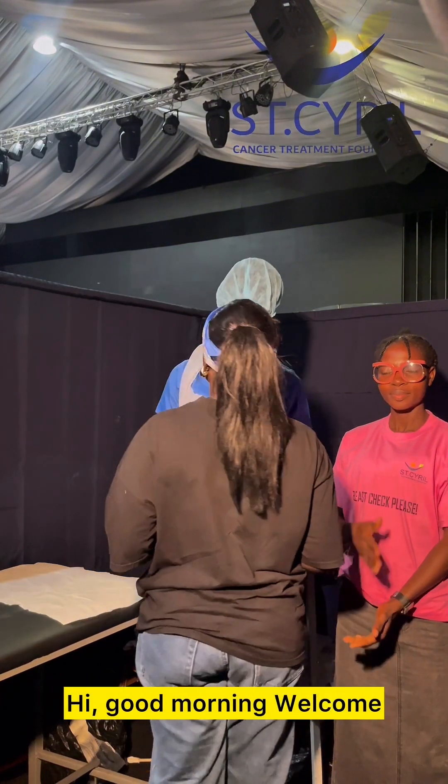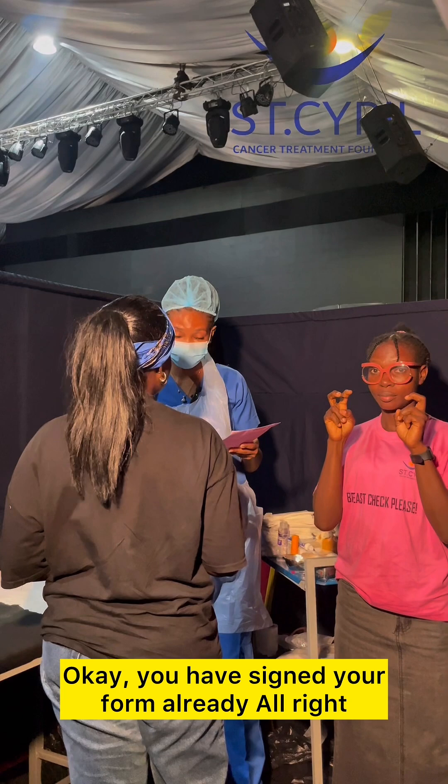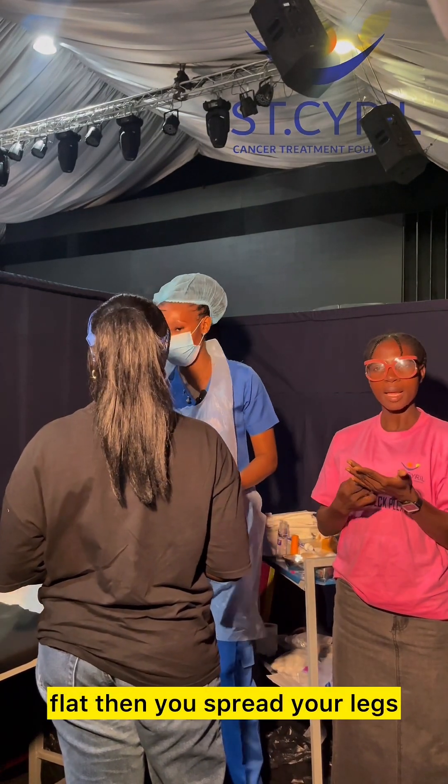Good morning. Good morning. Welcome. So you are here for your cervical screening test. You have signed your formal consent. All right, all you have to do now is just to lie down flat, then spread your legs.